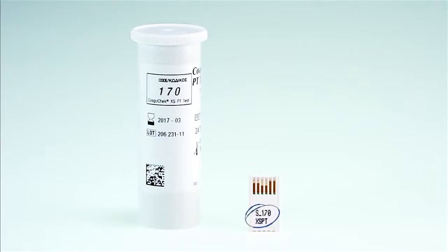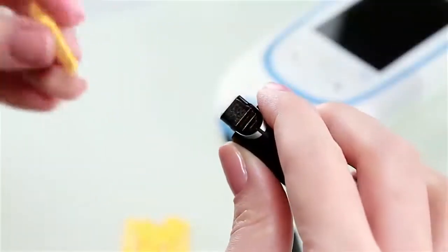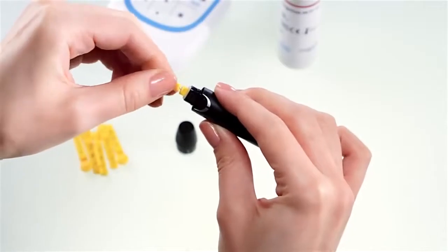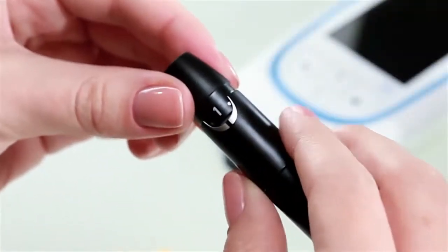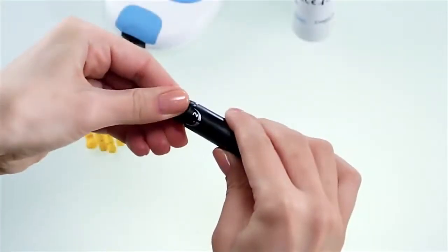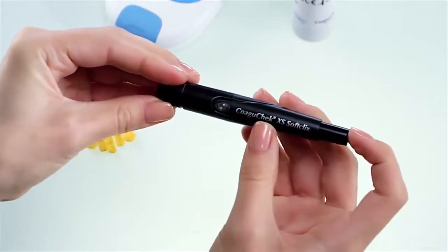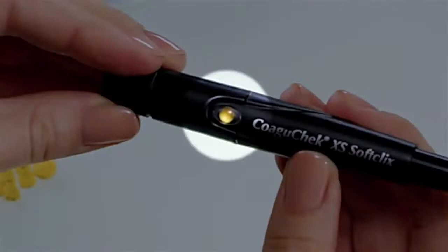Make sure that the code chip belonging to these test strips is available or that the chip has previously been used in the meter. Prepare the lancing device by inserting a fresh lancet needle. Carefully twist off the end of the lancet and discard it. Now replace the top of the lancing device and select a depth setting to suit you. Prime the lancing device by pushing the end of the device all the way down. The release button on the side of the lancing device has now turned yellow, indicating that the CoaguChek XS Softclix is primed and ready for use.